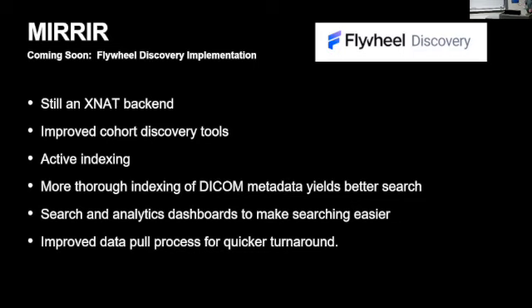It's an XNAT backend, but it's got improved tools for discovery, active indexing into DICOM, going much deeper so that we can quickly search much more deeply into the DICOM to identify samples, and search and analytics dashboards to make identifying samples easier.